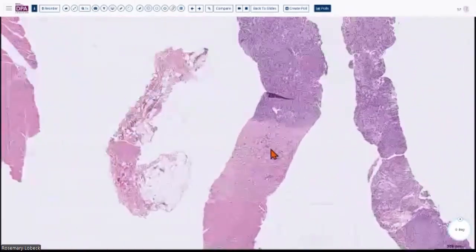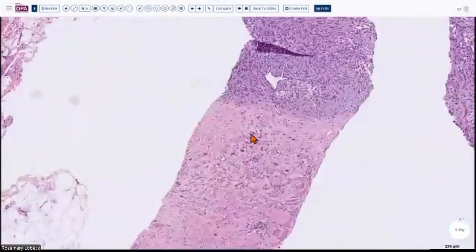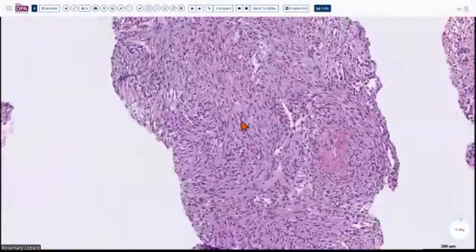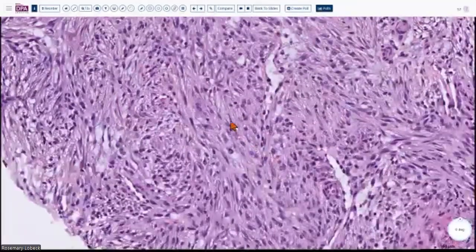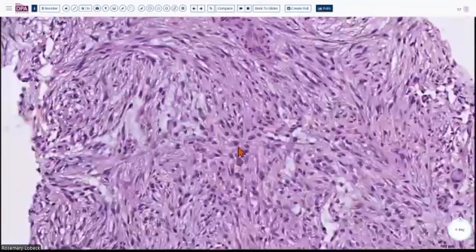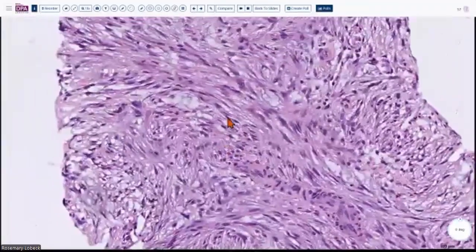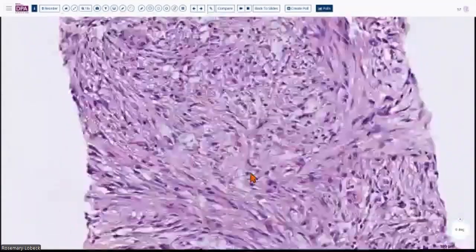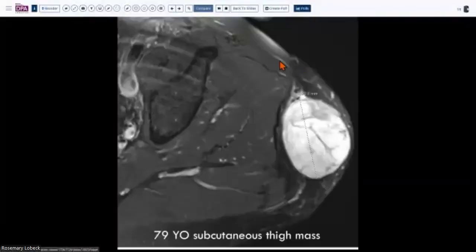So in this case, we can see this lesion which is arising from the fascia that is just above the skeletal muscle, and it's so cellular, right? Cellular with myxoid change, and sometimes you can find the plump nuclei, and you can also find a large amount of mitotic figures over here. So without proper clinical history, this can easily be misdiagnosed as at least an intermediate grade sarcoma. So watch out for nodular fasciitis.